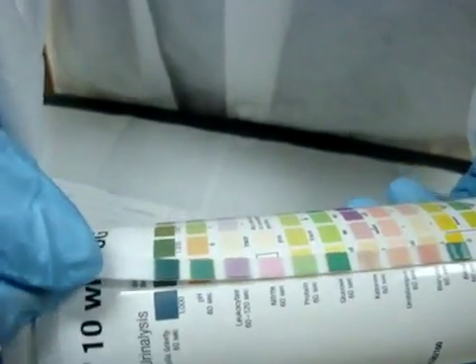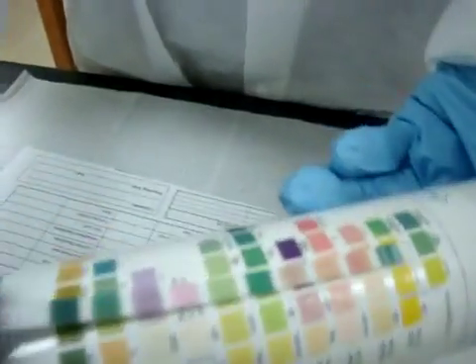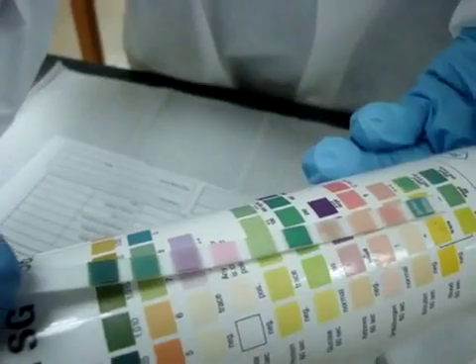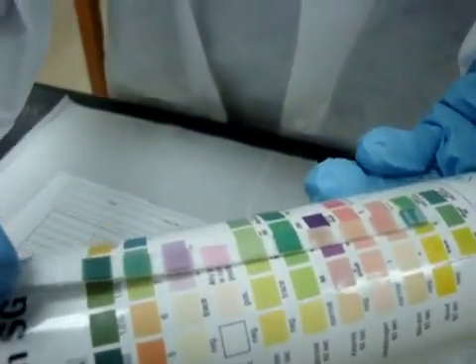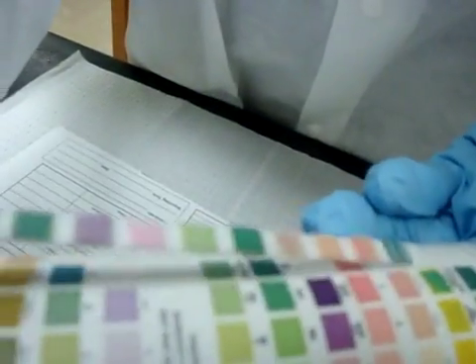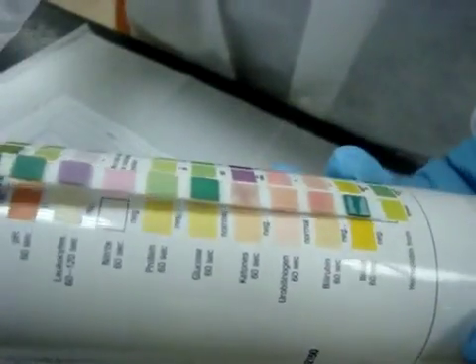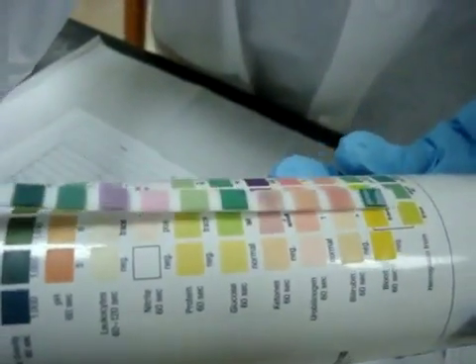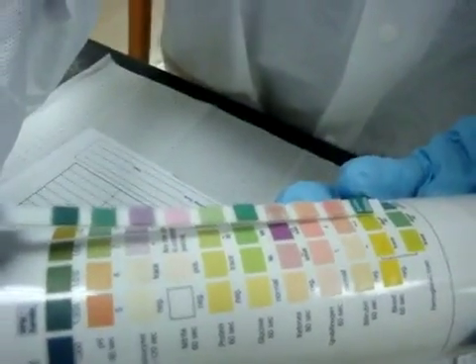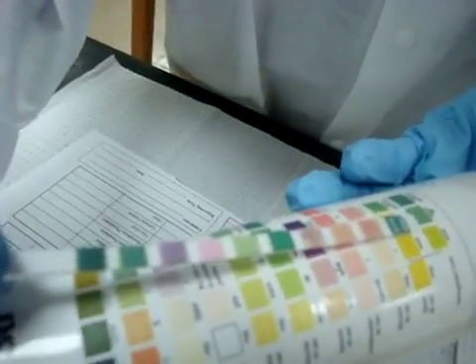There's a positive nitrite because it's pink. The protein is, as you see, it says 100 plus, so it's a 2 plus, and that's the way we report it in our lab, is a 2 plus. When we get to glucose, we see that it is between 250 and 500. The ketones are 1 plus. The urobilinogen is 4. The bilirubin is 3 plus.